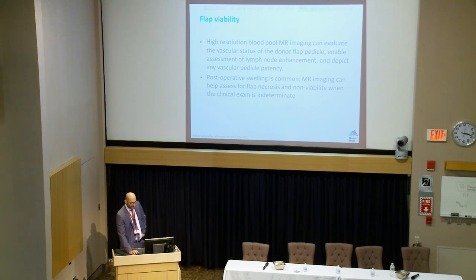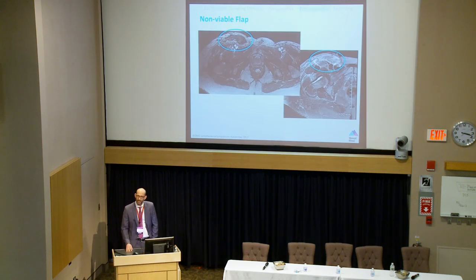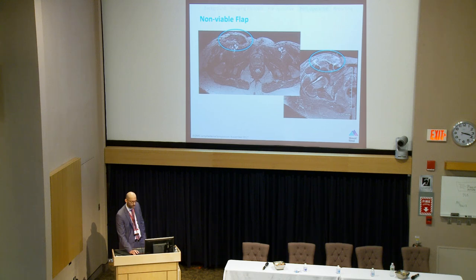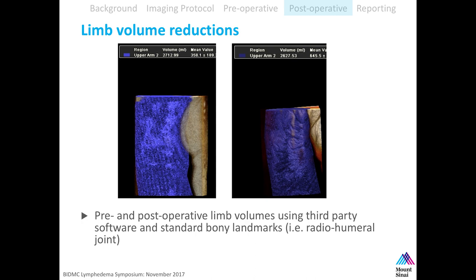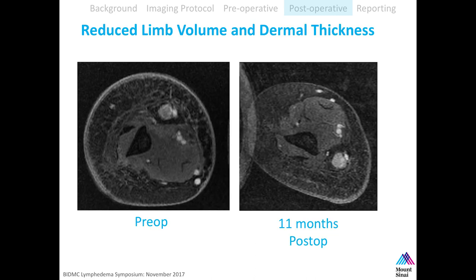For flap viability, postoperative swelling is common, but we want to look at the flap contents. On fluid-dark, fat-bright images, here is a groin flap that is not viable — it's edematous, totally dark, and unfortunately this flap was infected. Here's an example of limb volume reduction measurements using third-party software. On axial images, you can see nicely the reduction in fluid content and skin thickness — you can have a global 3D assessment or an axial assessment.